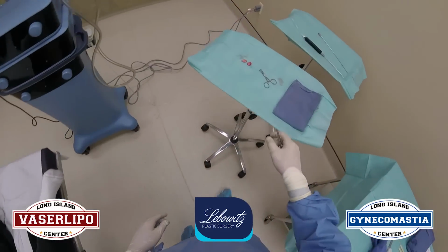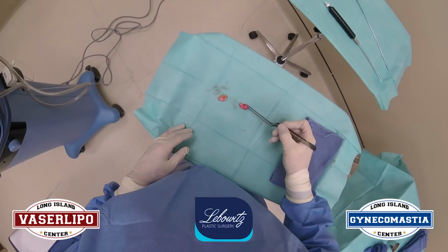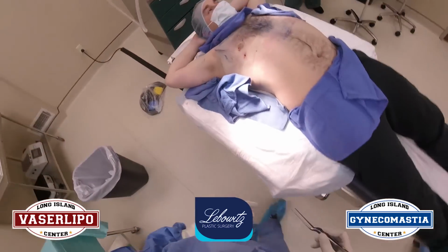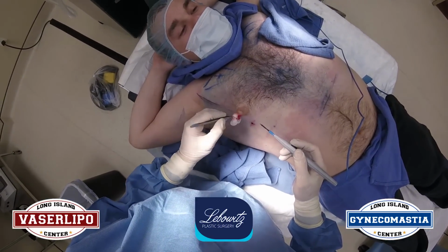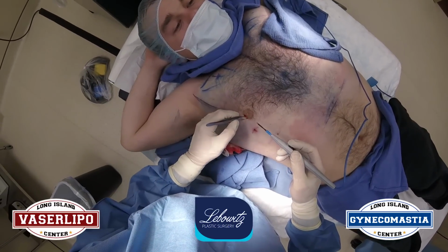So these are the two glands I got from the sides. Again, I did a big meatball into a little tiny slider on both sides. So the incision, as you saw, is so petite, so small. So this is my cautery. It's the best cautery in the world. Again, bought at the doctor's toy store.